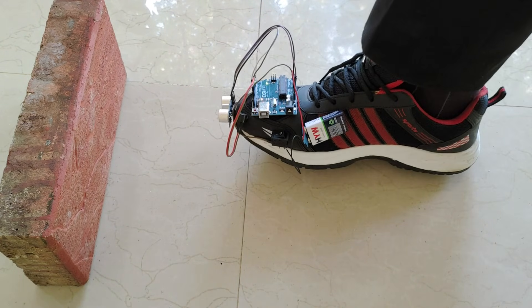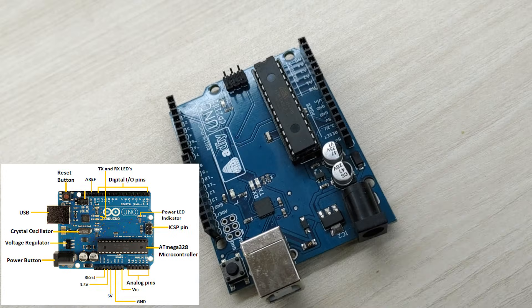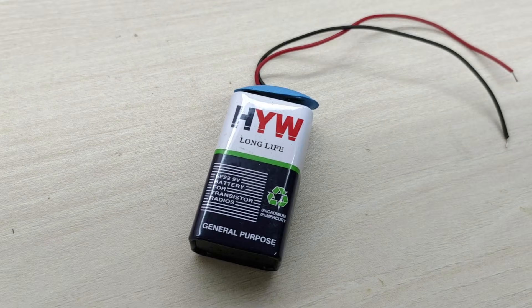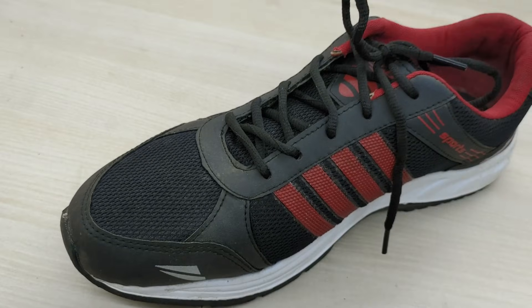Now let us learn how to make this project. For this project, you need an Arduino Uno, HC-SR04 ultrasonic sensor, a 9V battery with connector, a buzzer, a switch, and lastly, a shoe.